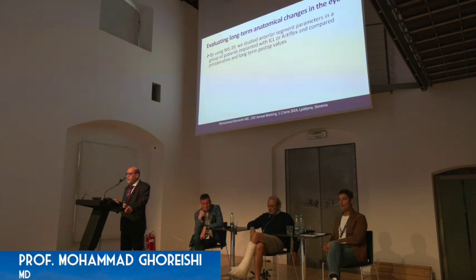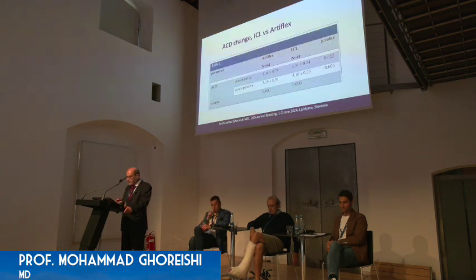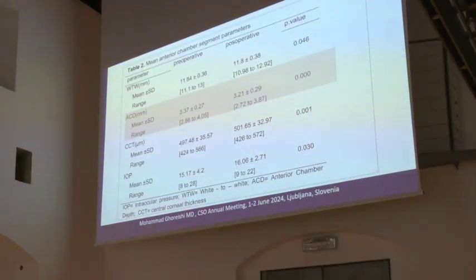For postoperative evaluation, I recalled my ICL cases after long follow-up, up to 10 years, mean follow-up 6 years, and measured all parameters. There were significant changes in most values over time, especially anterior chamber depth.